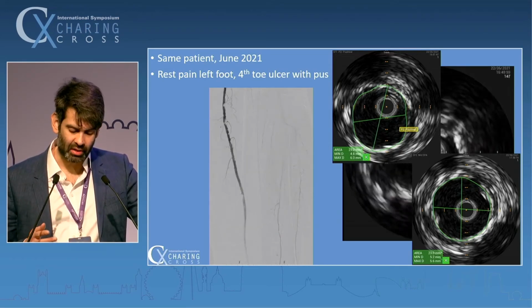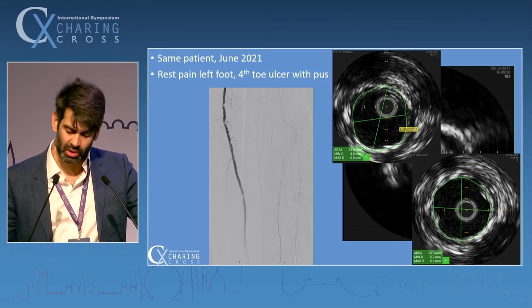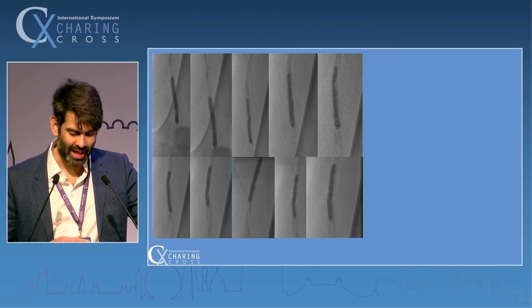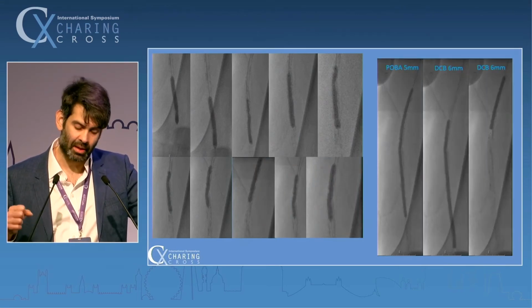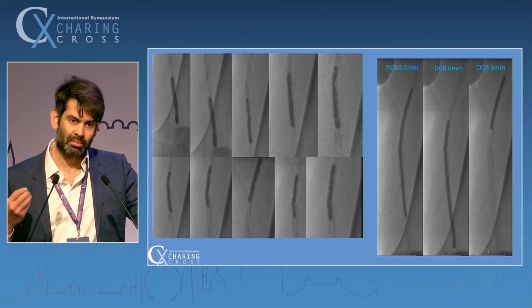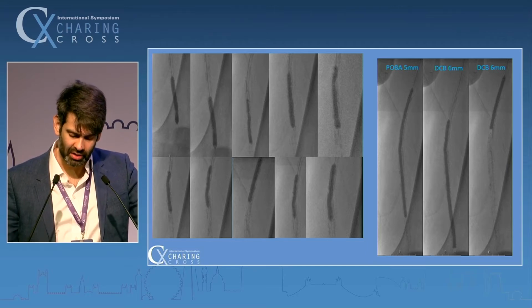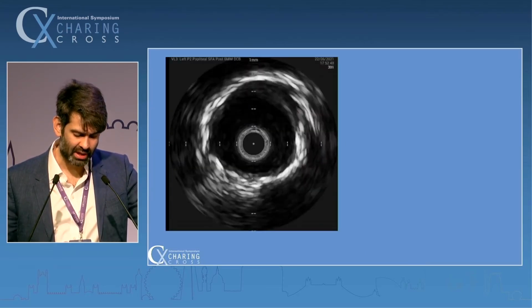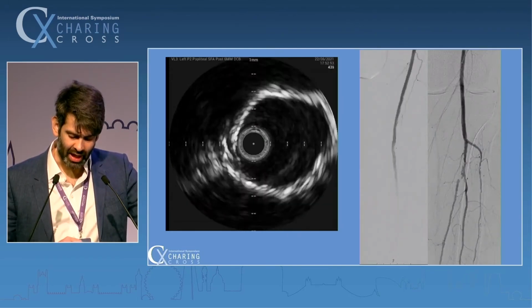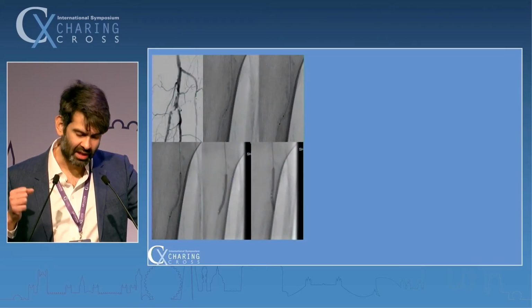So we used the intravascular ultrasound to size accurately for the procedure. As has been mentioned before, it's important to oversize the balloon correctly to get good wall apposition. You can see the Shockwave balloon expanding without any additional inflation, which means that the Shockwave pulses are breaking the calcium and changing the compliance of the vessel wall. We see a plain balloon angioplasty and a drug-coated balloon angioplasty, and we end up with this IVUS image, which shows a greatly improved luminal gain, an excellent flow on the angiogram, and no trash at all in the tibial vessels.